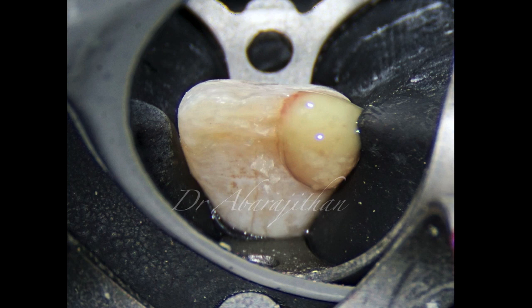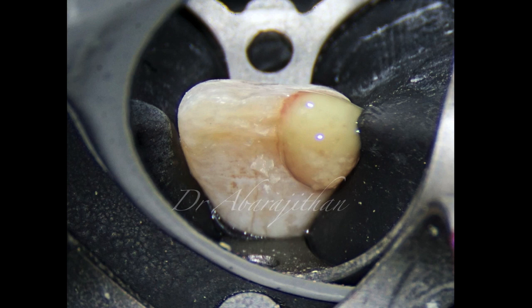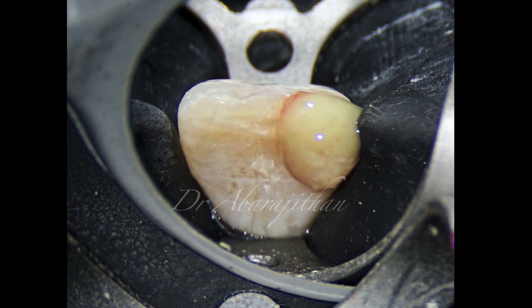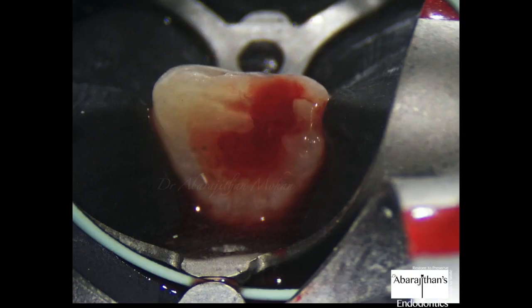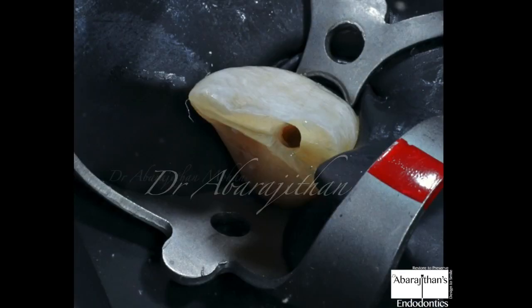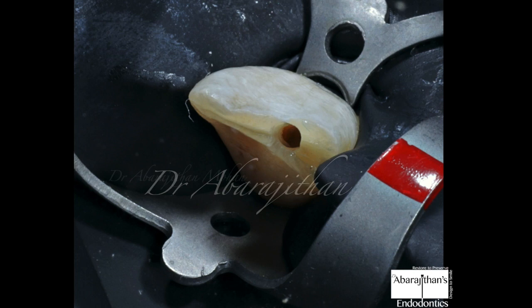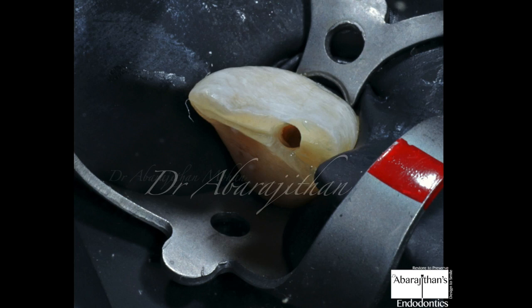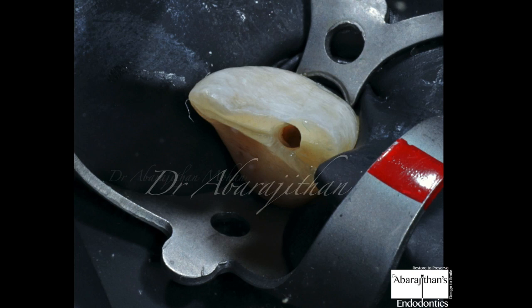It's a misconception that if there is pus, it is not an ideal candidate for a single-visit endo. Under isolation, when we perform the cleaning and shaping procedure with irrigation and allow 10 to 15 minutes, you can see the pus discharge turns to a serous exudate, and after another 5 to 10 minutes — about 15 to 20 minutes total — the canal can be completely dried. The only contraindication for obturation is when you cannot dry a canal, and since we achieved a dry canal, I performed a single-visit endo and single-step apexification here.